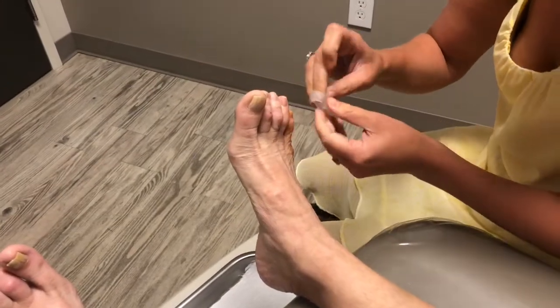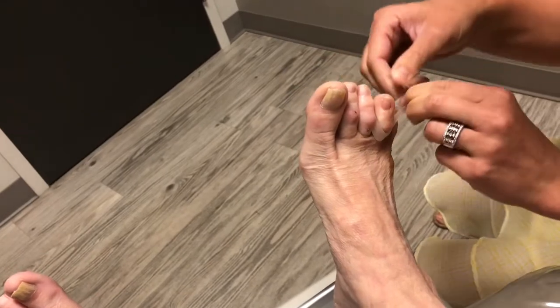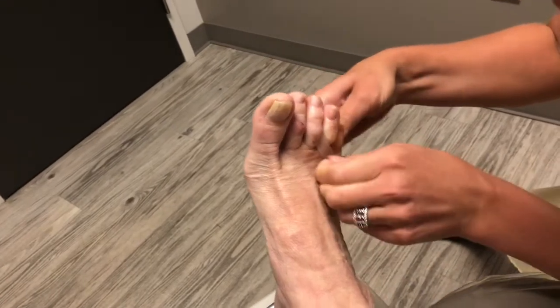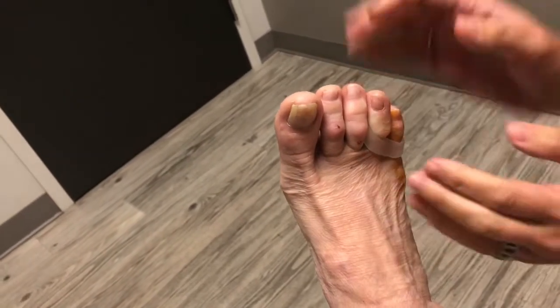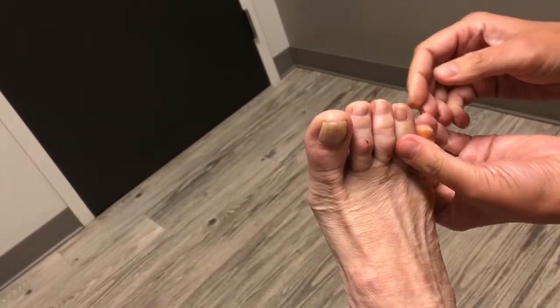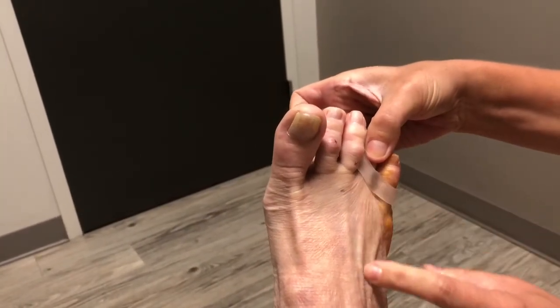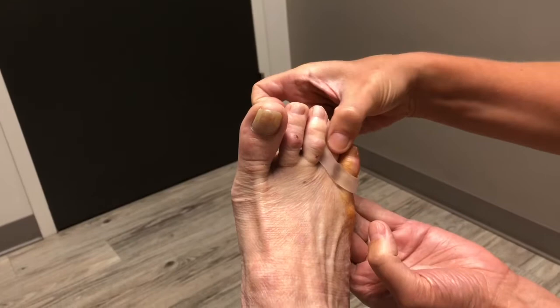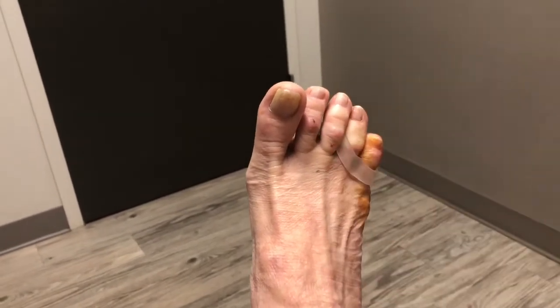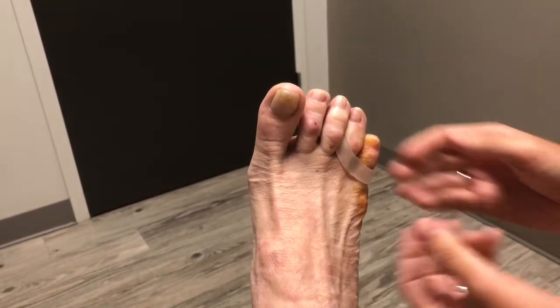Professional opinion — what do you think? I think it's a lot better. As many times as you've been here, you could be a podiatrist by now. So what are you putting on there, Dr. Brown? This is a little toe buddy. What I'm trying to do is pull this guy down — it's really designed to keep them in place, keep them in their own lane. Tape underneath here to plantar flex, because this guy is so tight. See how tight that tendon is? I'm going to tape it first to plantar flex or pull this down, and then keep the buddy on here to keep them separated and positioned straight.